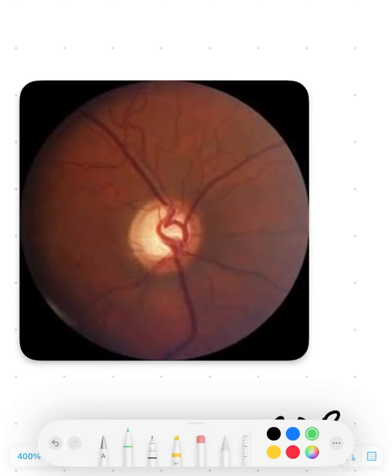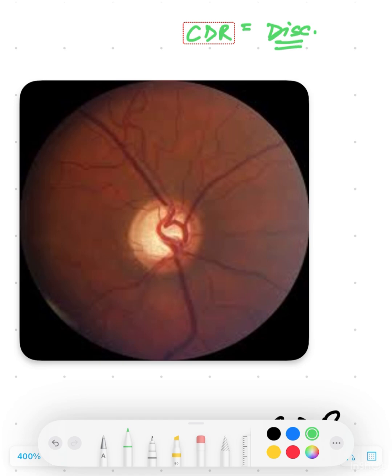Hello everyone, welcome back to Ophthalmology on the Go. Today we are going to see how to determine the cup-disc ratio of a given optic disc. The cup-disc ratio is the ratio between the cupping you see in the optic disc to the size of the disc. There can be inherently large discs or small discs, as well as tilted discs and other variations.